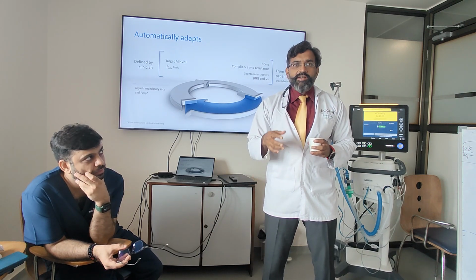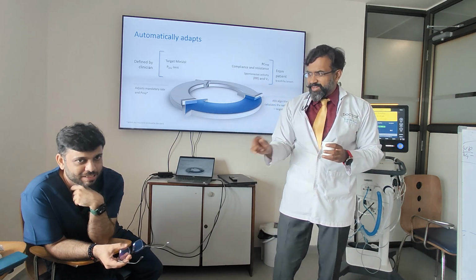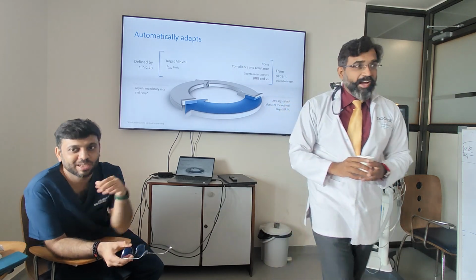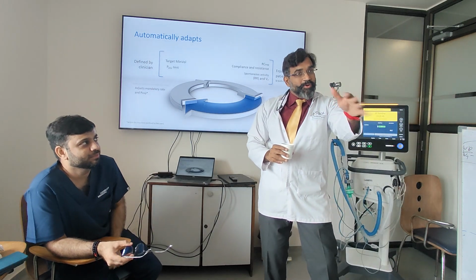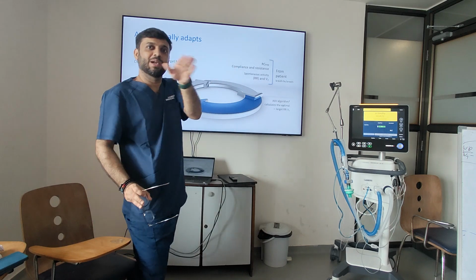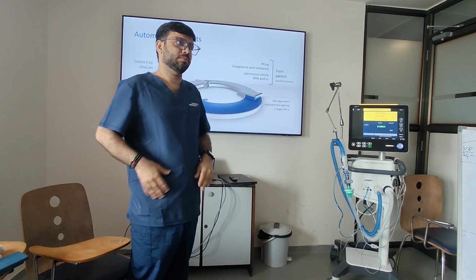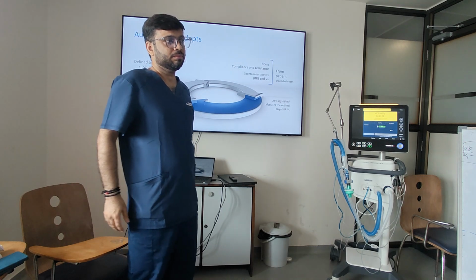What this does is it converts that RR from volume control to pressure control. You know this, right? Beautiful. And it reduces the volume. You can understand this when you look at the graph. It's so beautiful. So it will not give the same volume at those number of breaths. Exactly. Because you might think, if it is going to give volume, then the volume will increase everywhere. It doesn't do that.